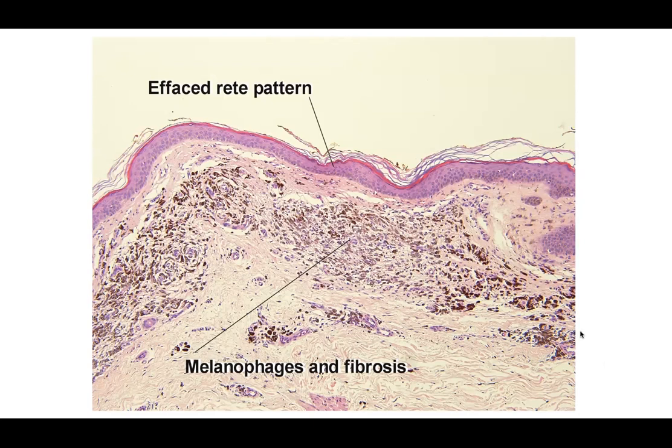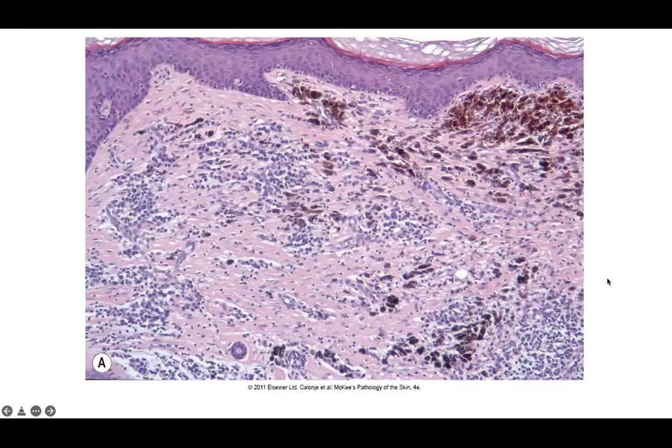This is a type of process called tumoral melanosis, which means that there was probably a melanocytic lesion there. However, it's not detectable on current sections, and deeper sections often will even fail to show a legitimate lesion still persisting. And so that's often a phenomenon of tumoral melanosis, where you just have diffuse sheets of melanophages in the superficial dermis.